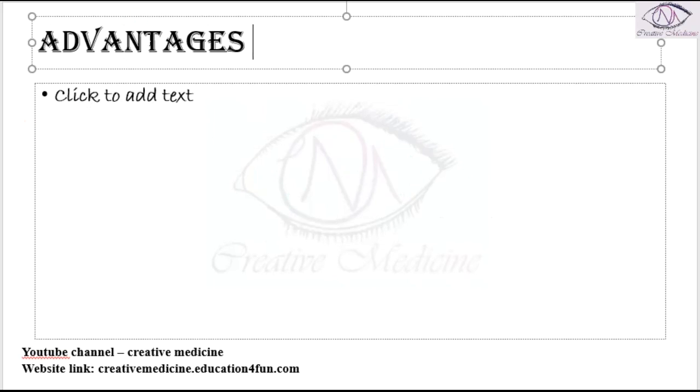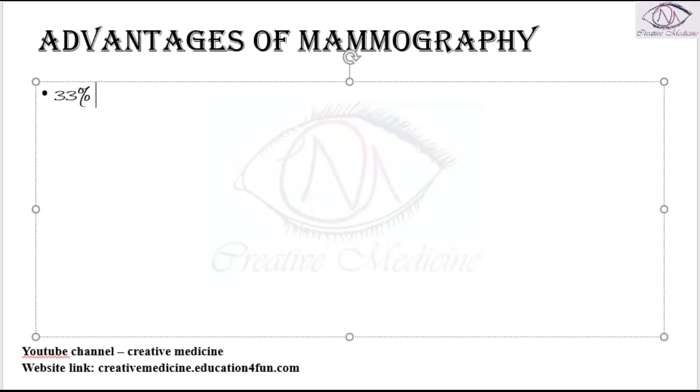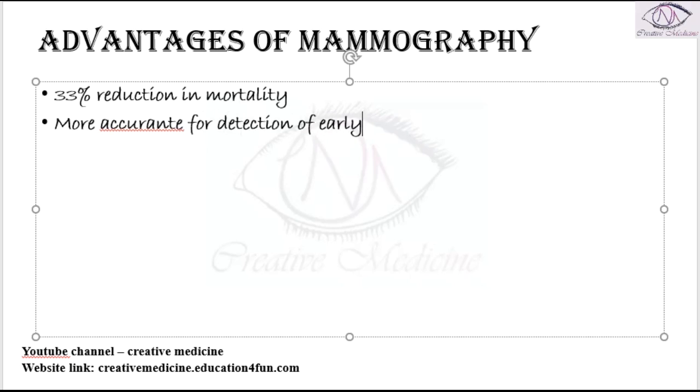Now, the advantages of mammography. Mammography causes a 33% reduction in mortality after screening, by detecting breast cancers earlier. Mammography is more accurate than clinical examination for detection of early breast cancers, and it provides a true positive rate of around 90%.